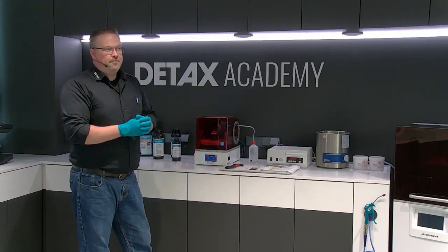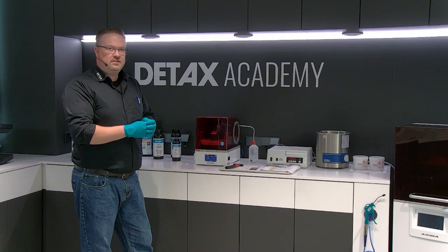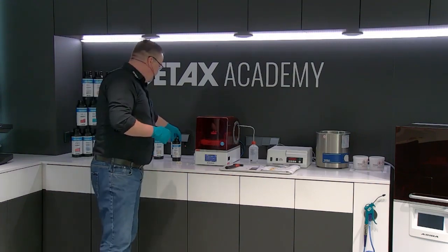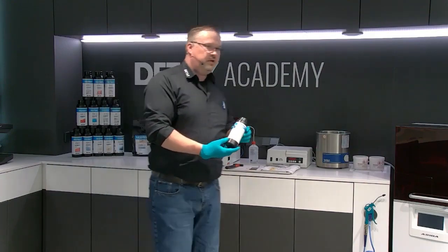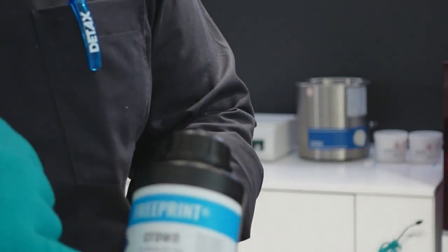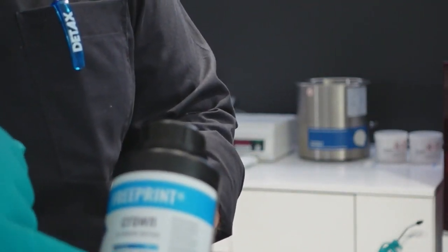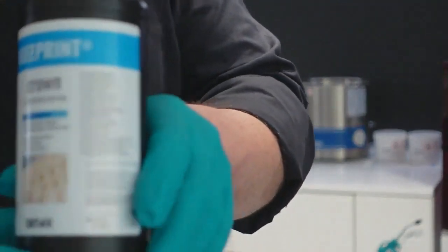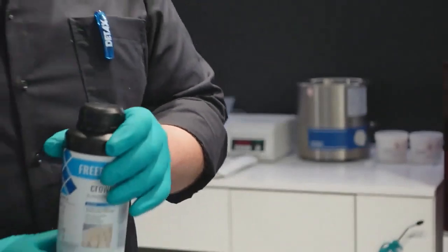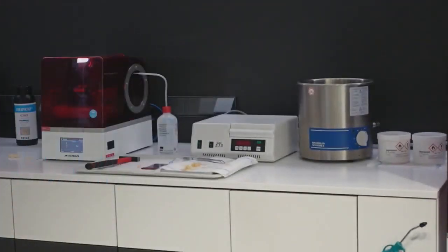After curing, you can go to the finish step, but I will show you once more our crown material in detail. This is the crown material. It is not only for crowns, it is for permanent crowns, of course. You can do bridges also. It is also possible for veneers and inlays.